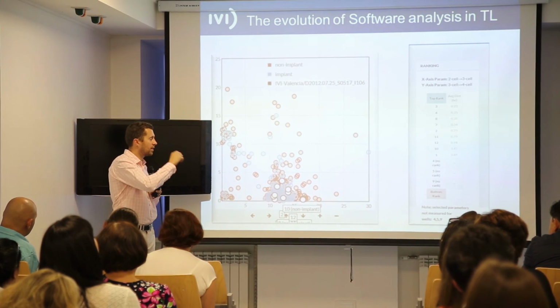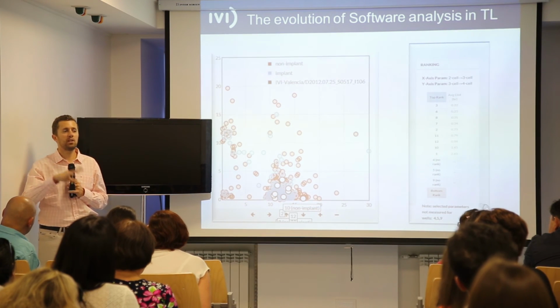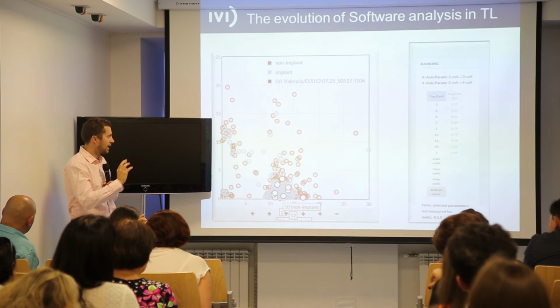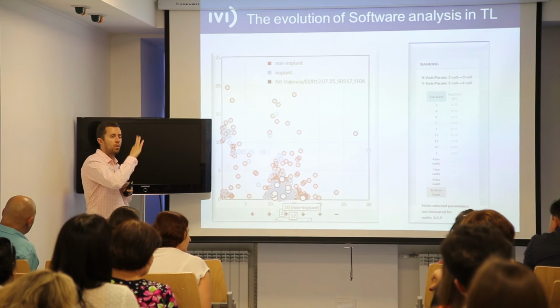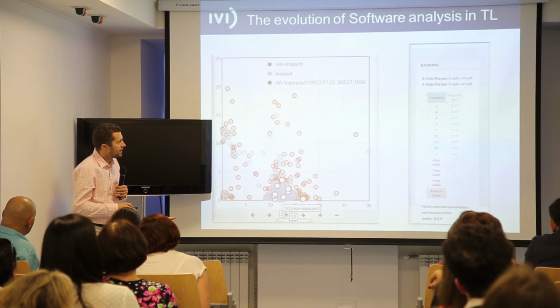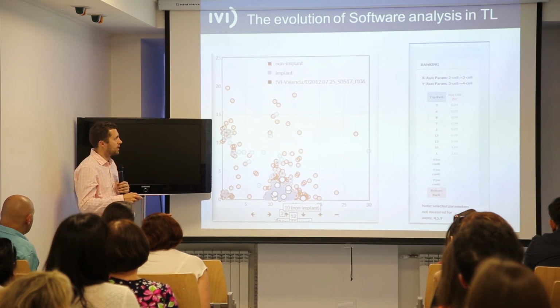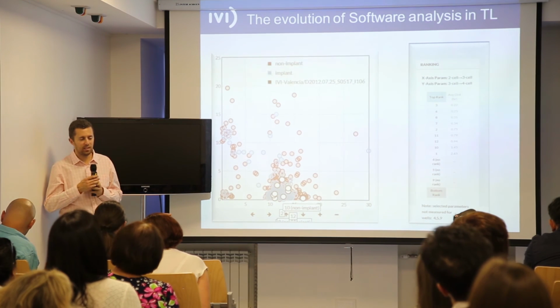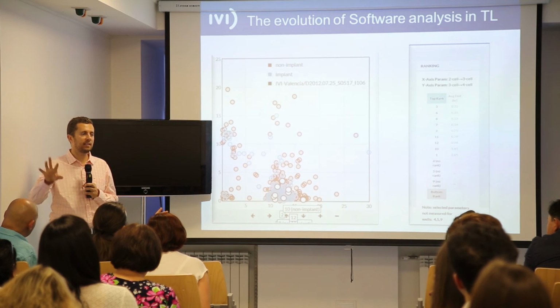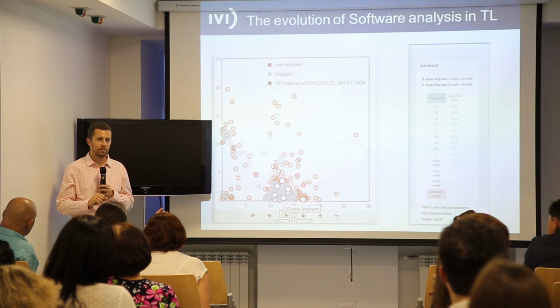The embryos are put in the graphic and automatically are compared with embryos that implanted. So I have a population of 1,000 embryos that implanted. On my first day of using time-lapse, I can compare the embryos of my patient with 1,000 embryos that implanted. So automatically the machine is giving me a ranking of the embryos. So I can have a direct rank between the first one and the second one, the third one. So the machine is telling me which embryo is more similar to the embryo that implanted in that clinic, and immediately I can get a classification of the embryos based on morphokinetics.